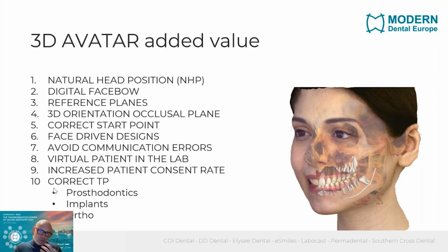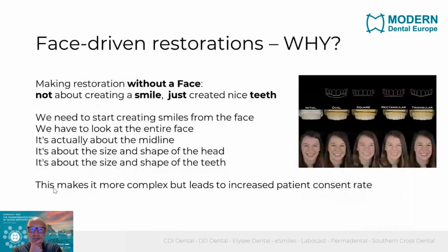So of course, the smile design will fit the patient better, more individually, and this will also help the patient actually agree with the treatment plan in the end. So: correct treatment plans, more predictable treatment plans for different indications, prosthodontic, implant work, ortho, or combinations.